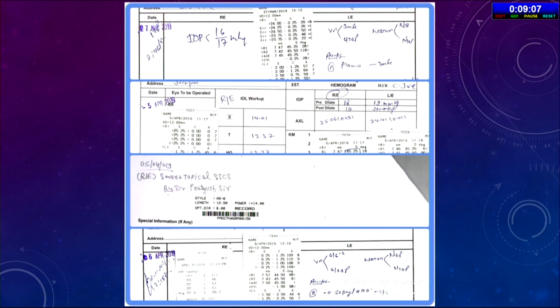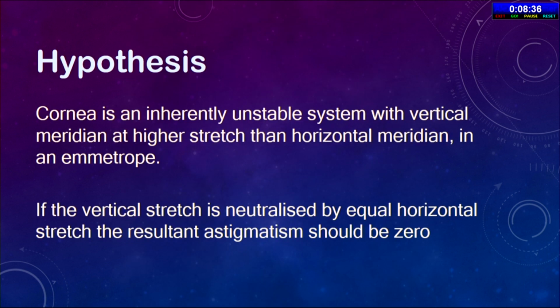The right eye, the patient had 3-meter finger counting vision. We did surgery of the right eye by a smart topical SICS, and on 6th April it is 6/6 and N6 with a monofocal lens. This is possible. You can try this. Let's use it as a spark, to let innovation sink into this SICS, because innovation can only push us forward.